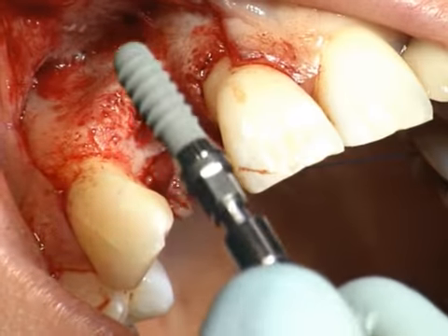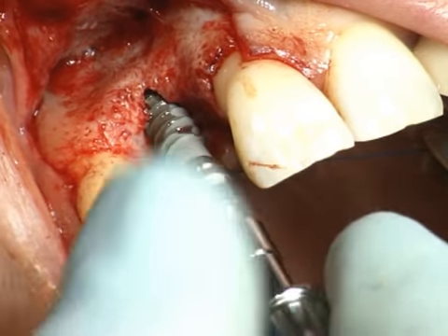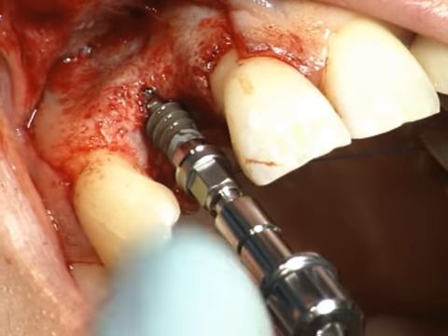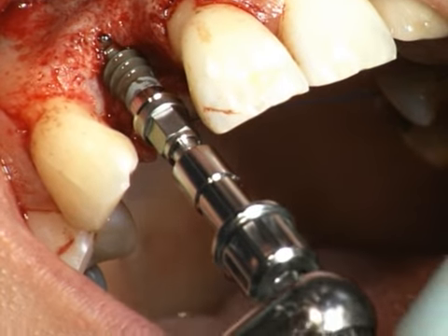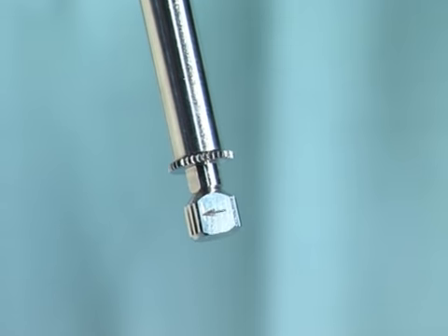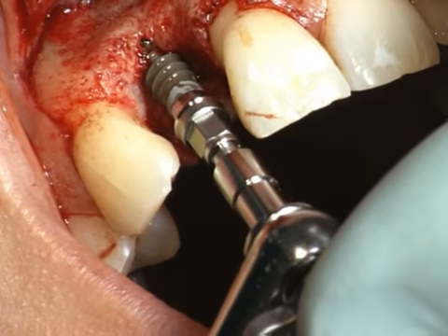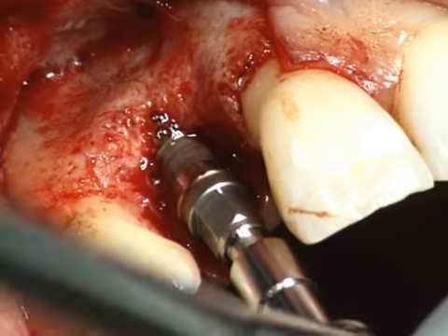The implant is now transferred to the prepared implant bed without contaminating it with saliva, blood or instruments. The ratchet is then placed over the adapter and the arrow on the ratchet is changed to clockwise. The adapter and ratchet are stabilized with the holding key and the implant is screwed into its final position with slow turns.